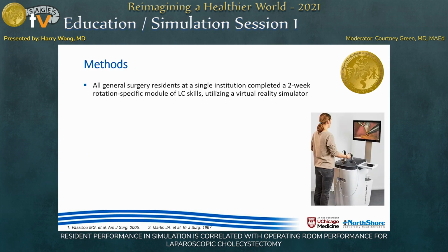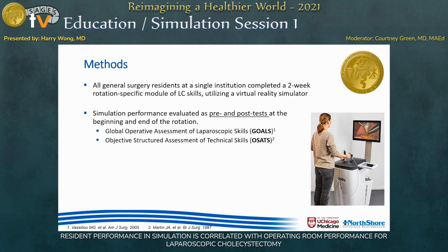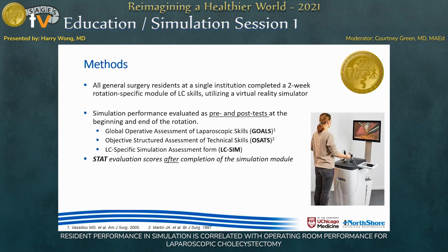Again, we collected data from the residents who completed the 2-week lap chole simulation module on the simulator, and again used the pre and post test to evaluate their performances using the GOALS, OSATs, as well as the lap chole specific assessment form. And this time we included their STAT evaluation scores, and we only included those scores that were collected after they had completed the simulation module.